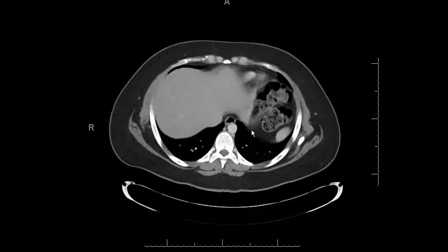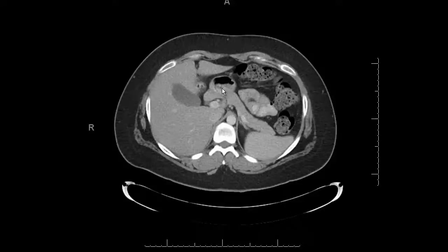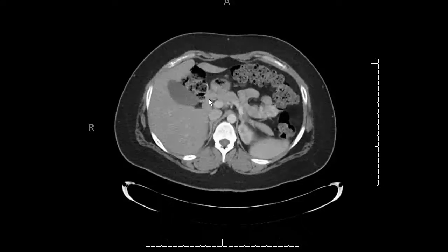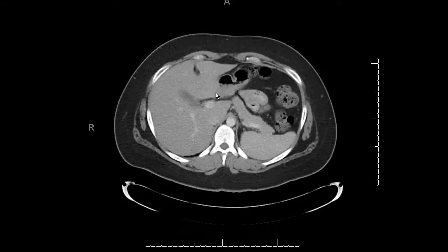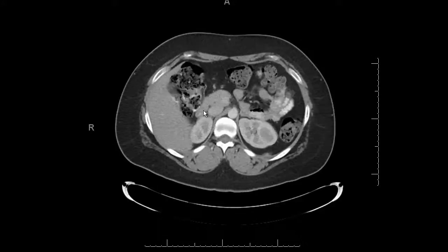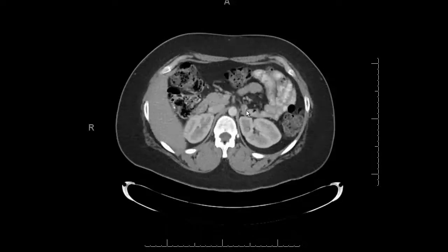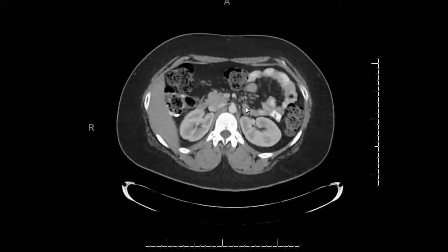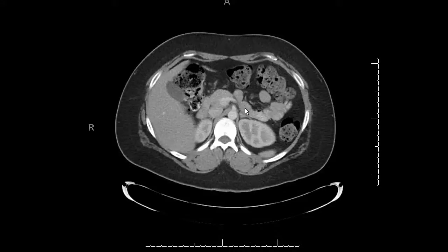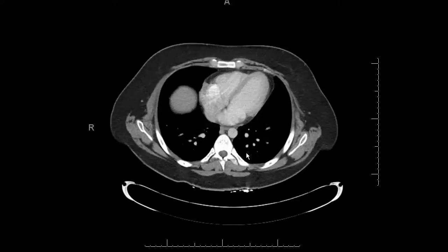Then I do the GI tract, starting at the GE junction and looking at the fundus, body, antrum, and pylorus, then into the duodenum. I trace the first, second, and third portions of the duodenum as it crosses underneath the SMA — a good way to find the third portion if you get lost is to find the SMA and look underneath it. Then the fourth portion, where it turns into other bowel loops at the ligament of Treitz.